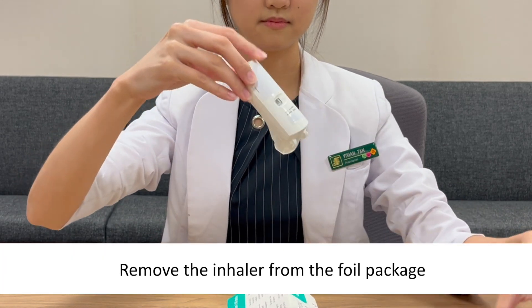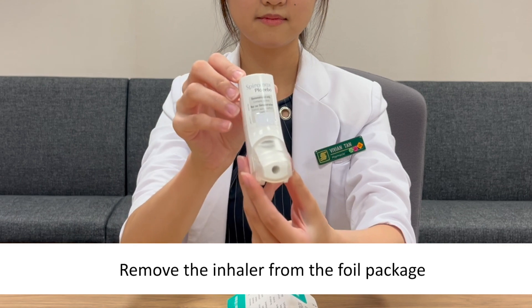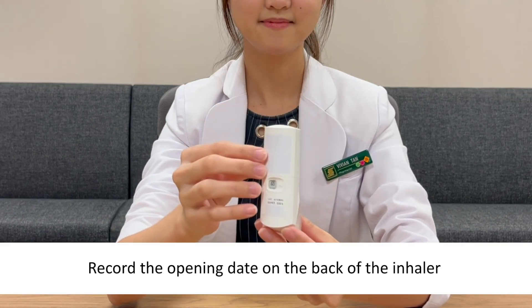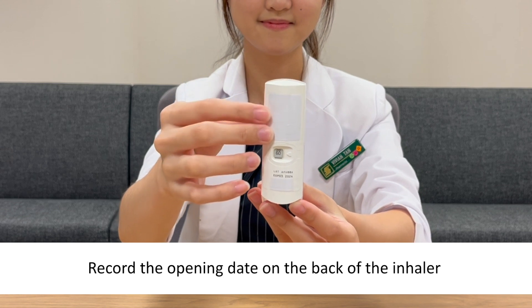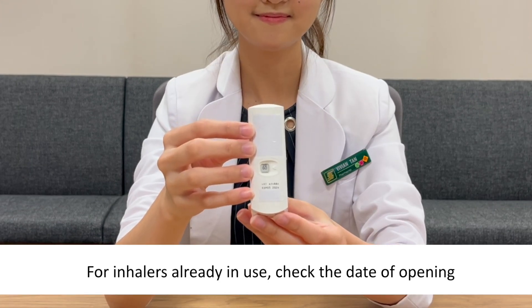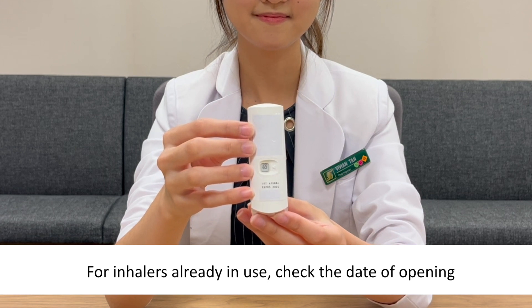Remove the inhaler from the foil package. Record the opening date on the back of the inhaler. For inhalers already in use, check the date of opening.